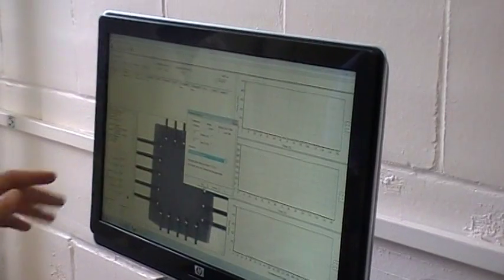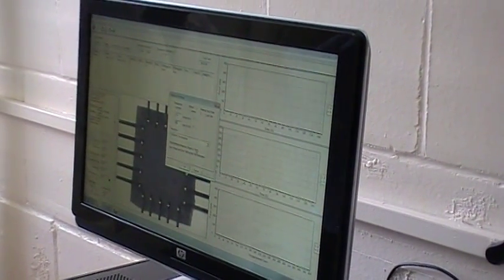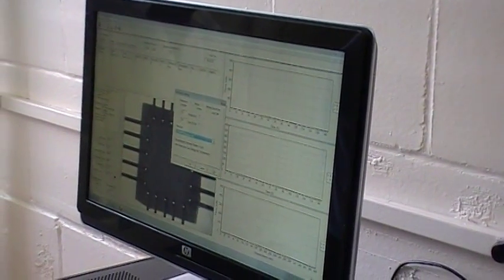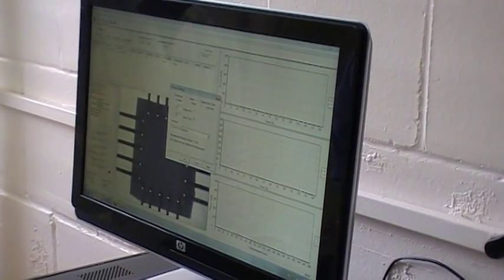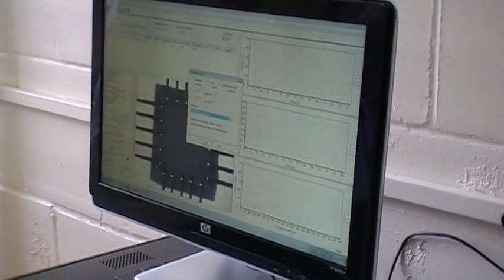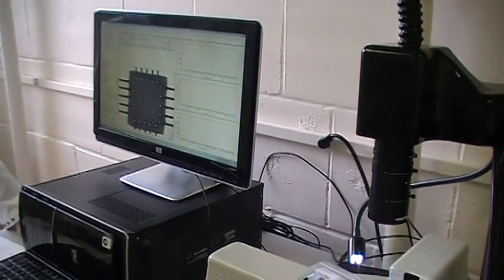We were saying this is good for the gain right now. You could darken it up ever so slightly. Got it. So I'll go down to like 15. Ah, that's a little too dark, actually. All right, so we go 20. That's perfect.